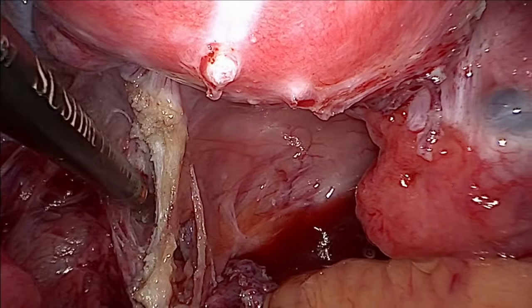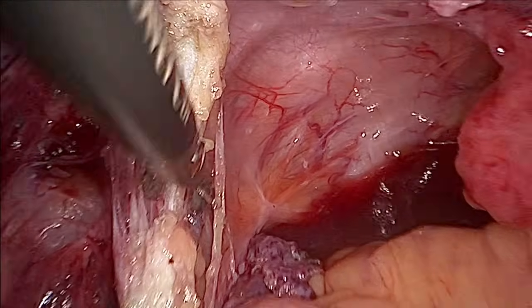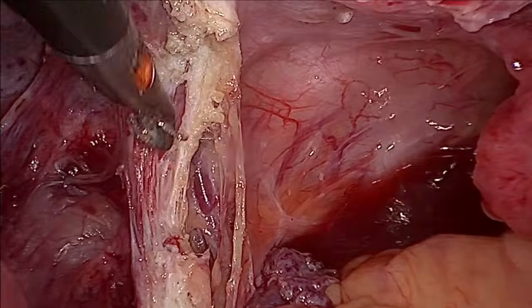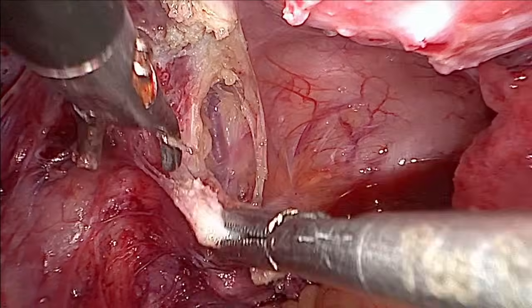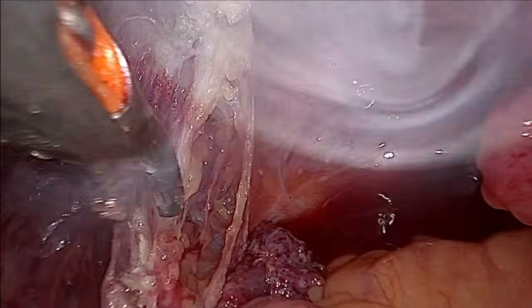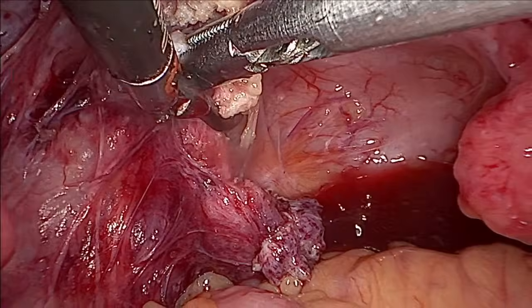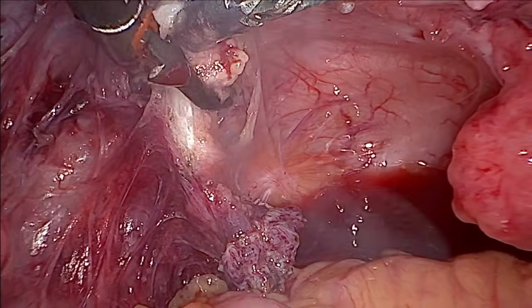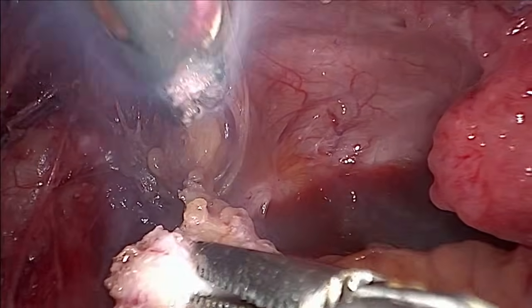To be very careful here. Sometimes you may be very close to the veins here. You can see the vein here. This is the fibrosis we need to remove. We will remove this fibrosis now.